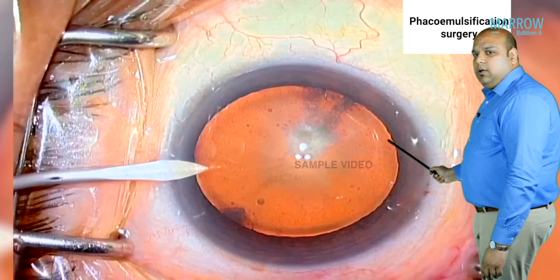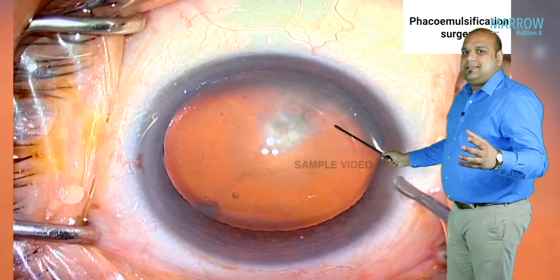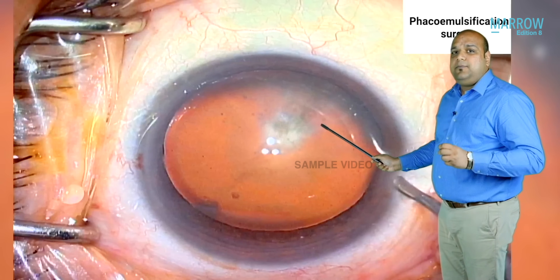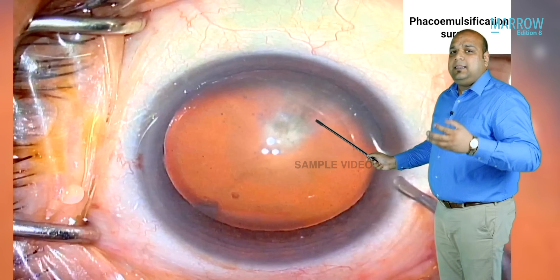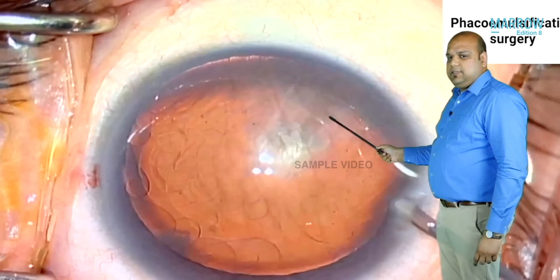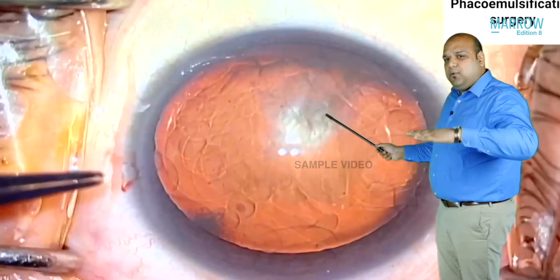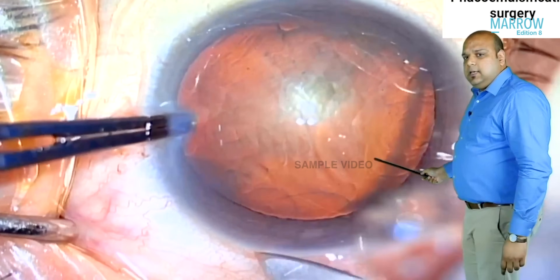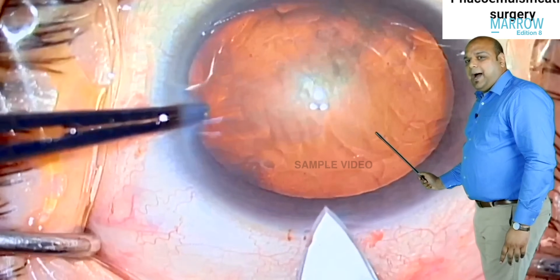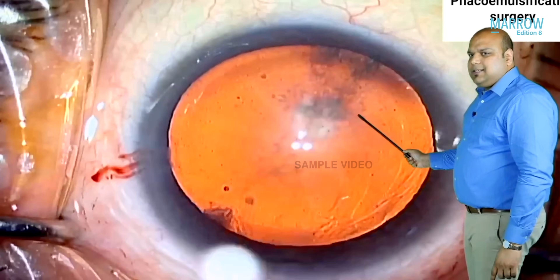The side ports help us inject viscoelastic. The anterior chamber contains aqueous humor which keeps leaking out, so we need to stabilize it by filling it with a more dense material — viscoelastic — giving us a stable surgical field. This surgeon then performs the main incision using a 2.2 mm keratome, which creates a bi-planar incision — first going into the cornea, then angling down.